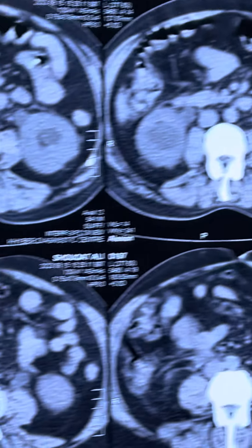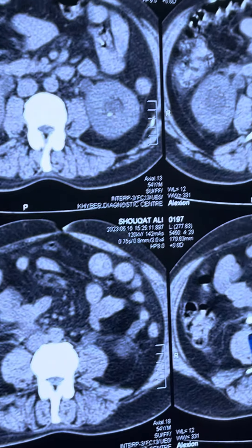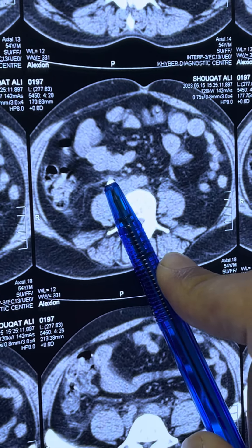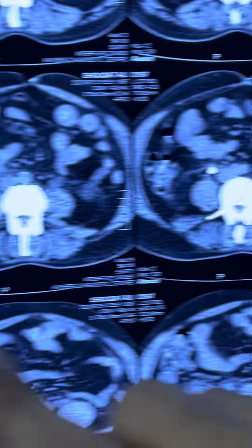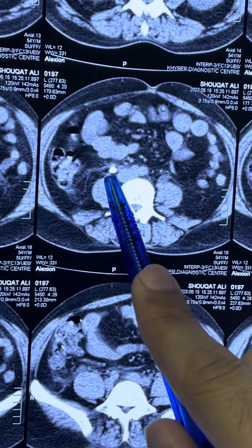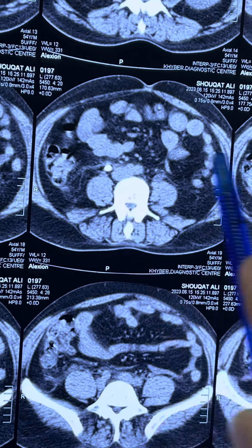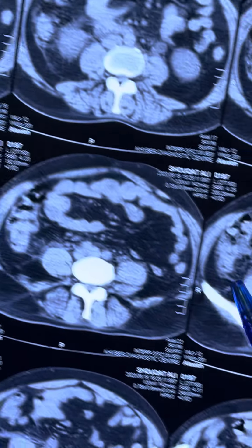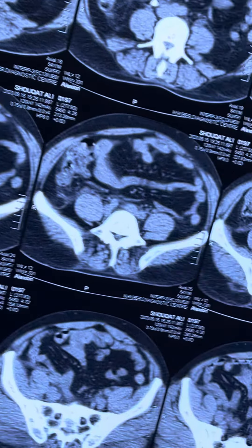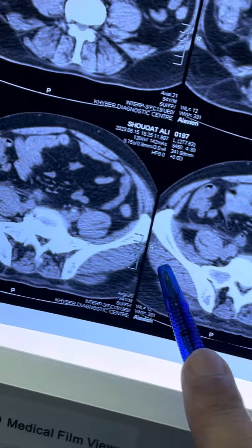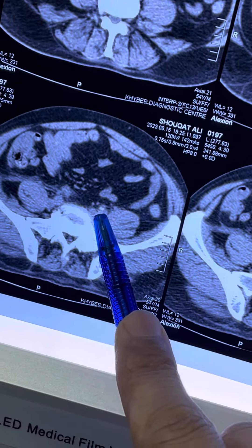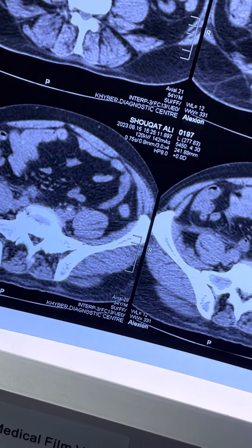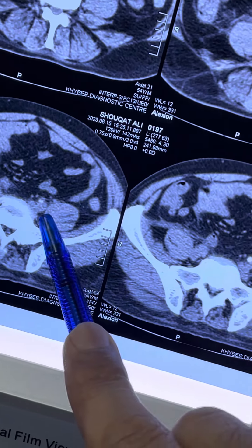Coming down, the radio-opaque shadow which is in the proximal ureter, below the level of the kidney, it appears here — proper radio-opaque shadow, one slide and two slides. Coming on this side downwards, a similar radio-opaque shadow appearing in the ureteric line on this side, as on the left side.